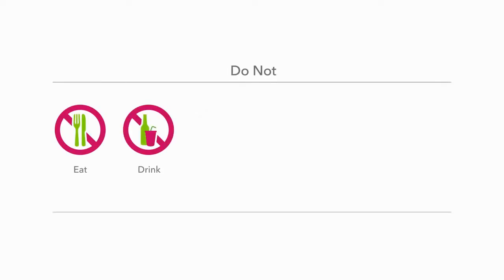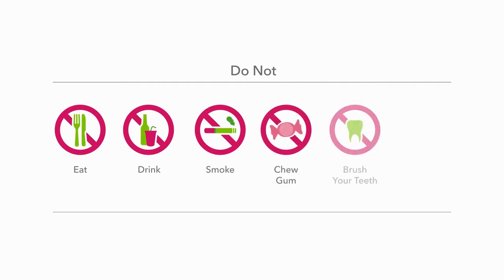First, don't eat, drink, smoke, chew gum, brush your teeth, or use mouthwash for at least 30 minutes before you start submitting your sample.